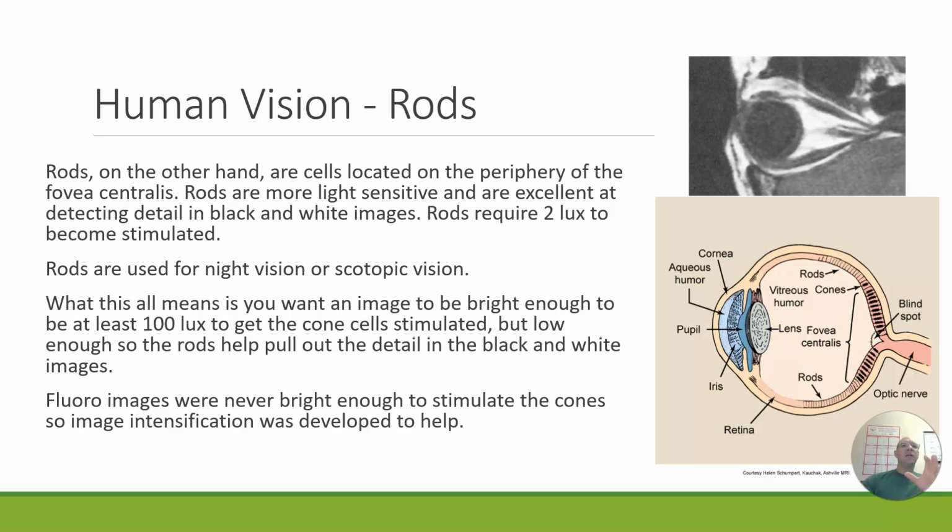So that's why something around 100 lux, maybe up to 1,000 lux, depending on the radiologist and what they're used to. They're in a dimly lit room around that light level to see if we can stimulate both the rods and the cones to get the best detail possible.